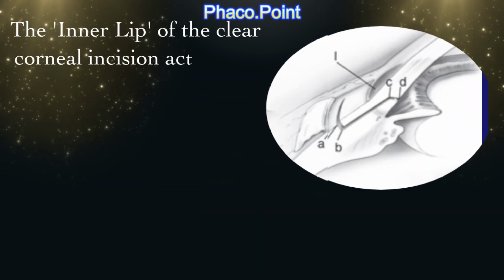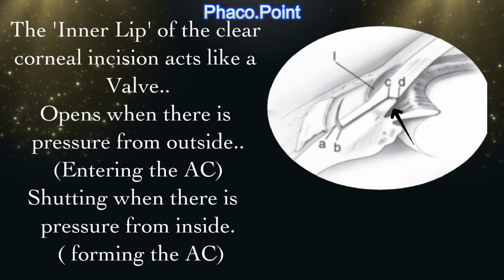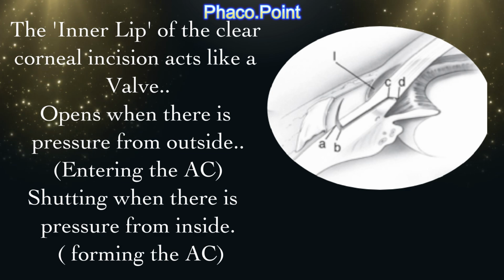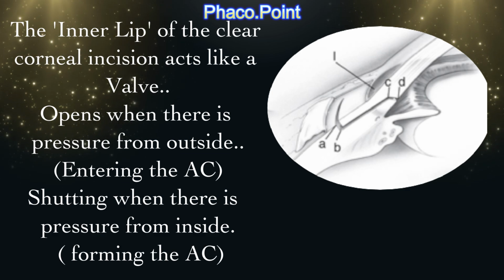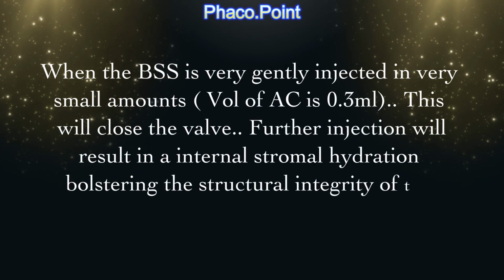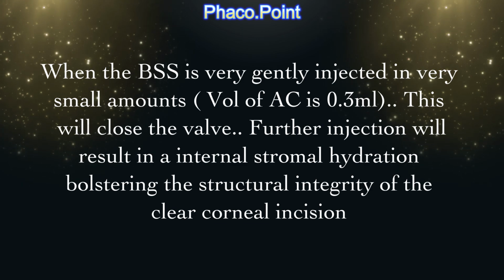The inner lip of the clear corneal incision acts like a valve, that's why it's called the valve clear corneal incision. This valve opens when there's pressure from outside, and it shuts when there's pressure from inside. Like when we form the anterior chamber, the valve will close. When the BSS is very gently injected in very small amounts, remember that the volume of the anterior chamber is just 0.3 ml, this will close the valve.